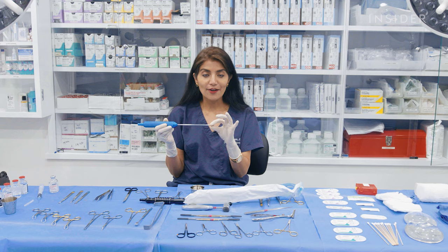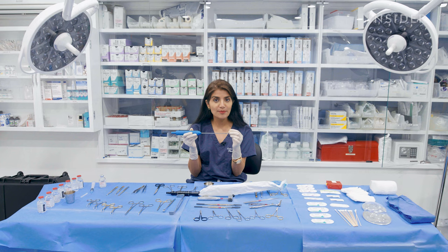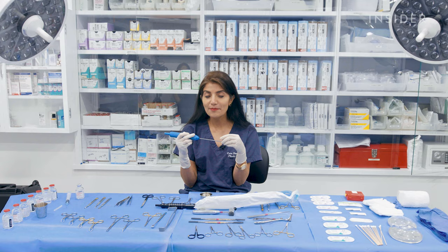There are also many different shapes on the heads of the cannulae. So they can have a smooth tip, a round tip, a basket tip, a spatula tip, cutting tips, blunt tips, and many different types of tips.